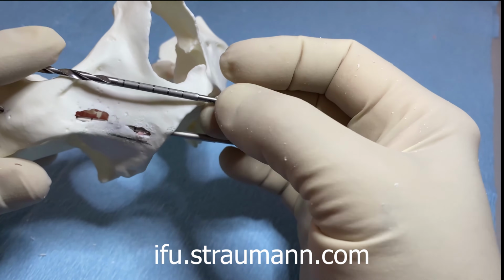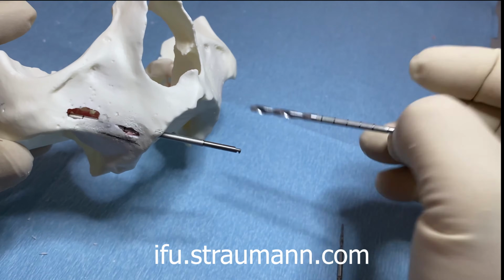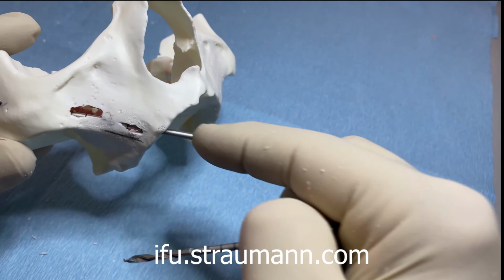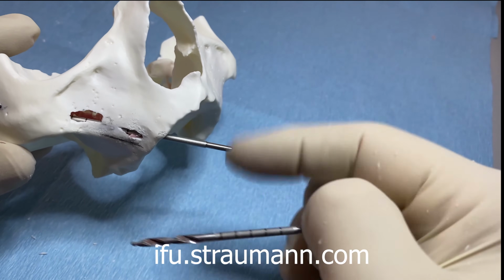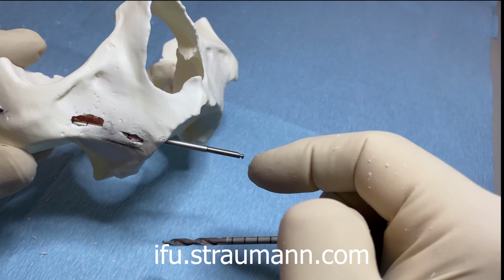But the shorter one passes the patient's commissure or their lips much quicker. If we're using the longer one, we have to be careful that the drill, as it's turning, doesn't burn the commissure or the lip on the opposite side.